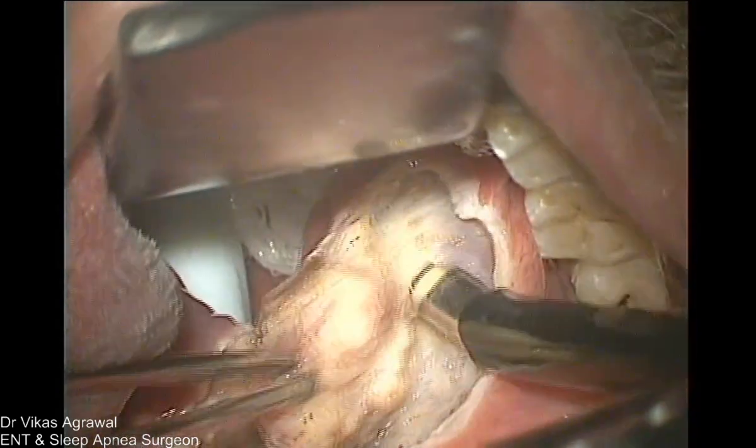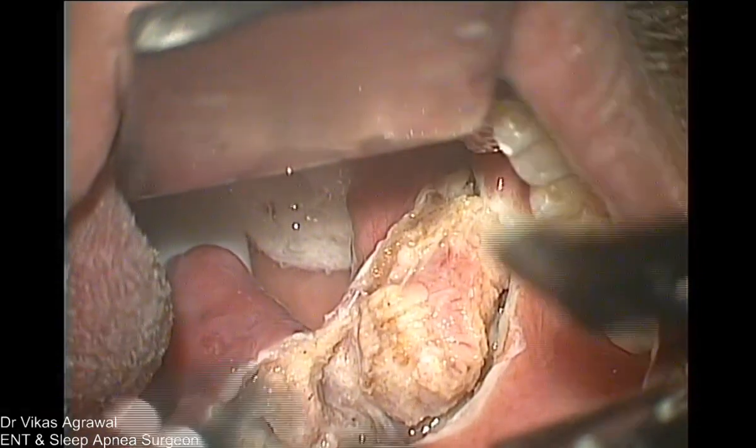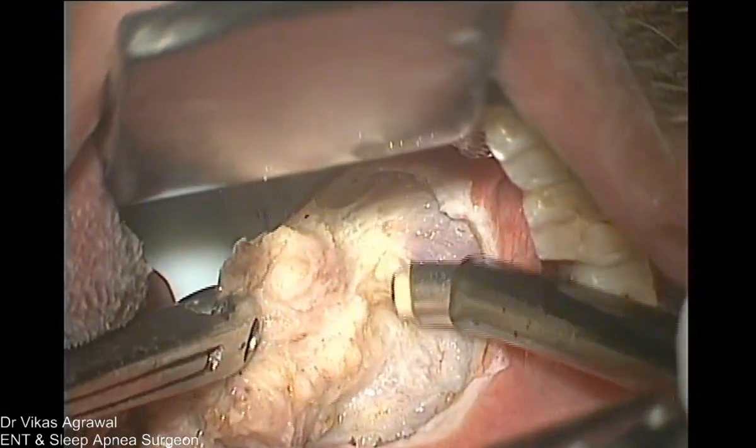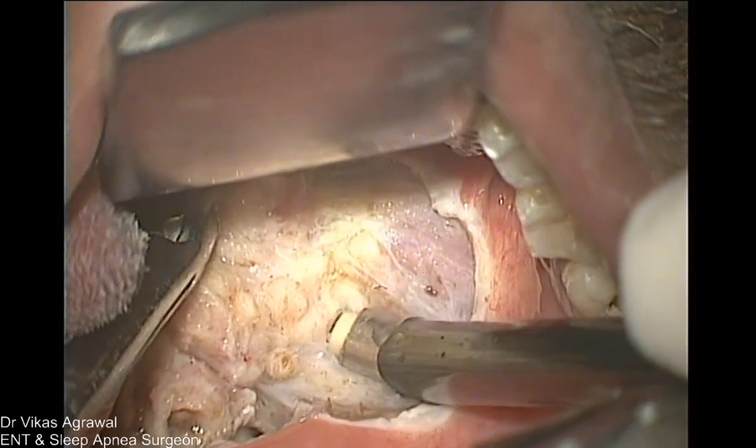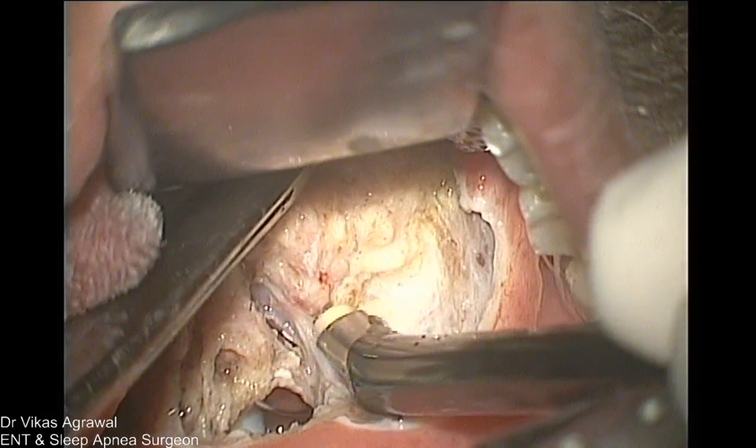Again, as we reach the lower pole, you can see there is a big lower pole. We will try to avoid a secondary bleeding in the post-op period by not exposing the lower pole.